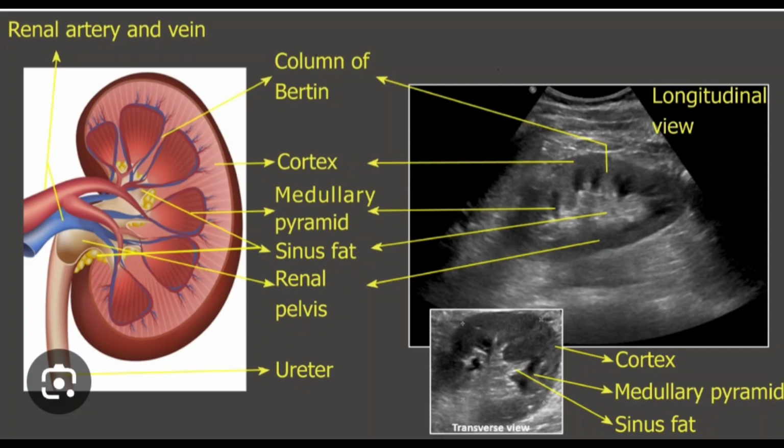Sometimes there is a pelvic dilatation. This may be congenital or this may be pathological. So you have to be careful whether this pelvic dilatation, or baggy renal pelvis, is congenital or there is some pathological process sitting. Ureter is normally not visualized unless it is dilated or enlarged because of an intraluminal mass or intraluminal stone stuck. Otherwise you cannot appreciate a normal ureter on ultrasound imaging.